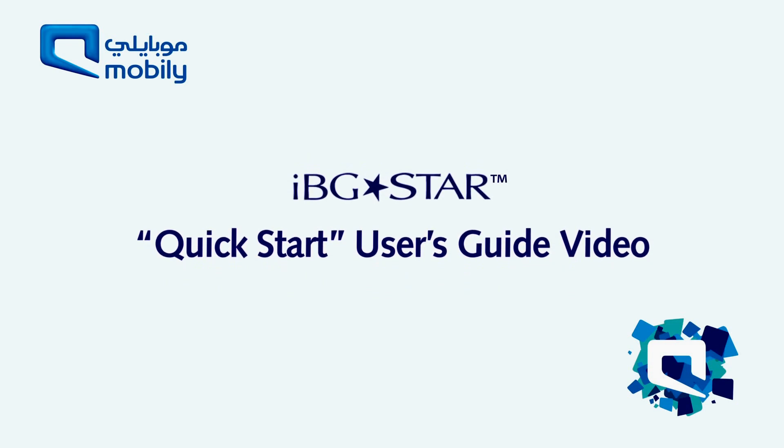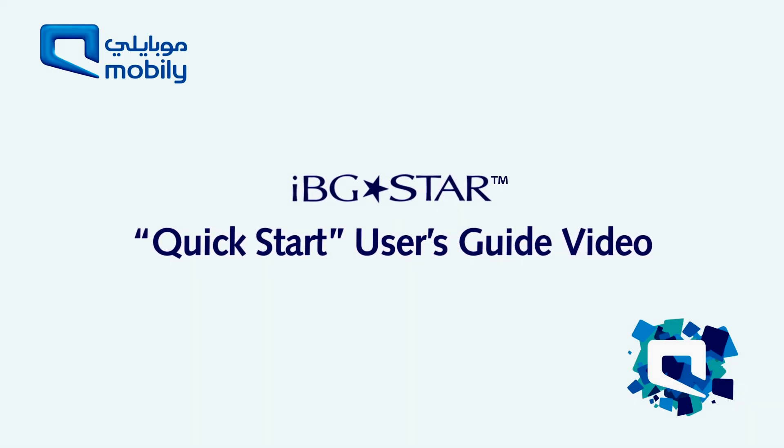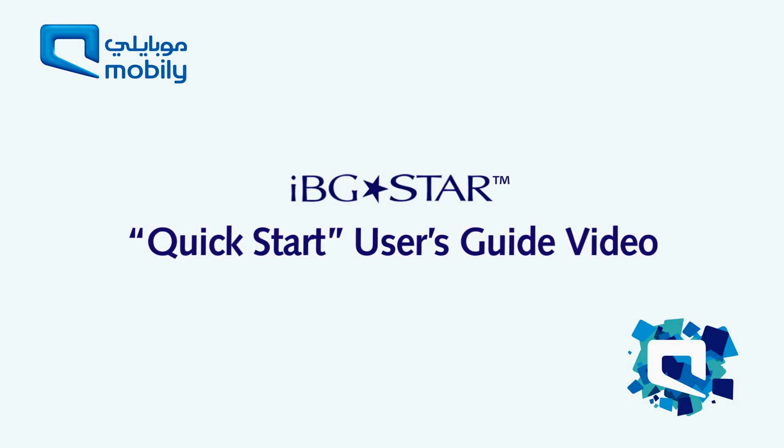Welcome to the IBGSTAR Quick Start User's Guide. This video will help ensure correct usage of the blood glucose meter from Sanofi Aventis.